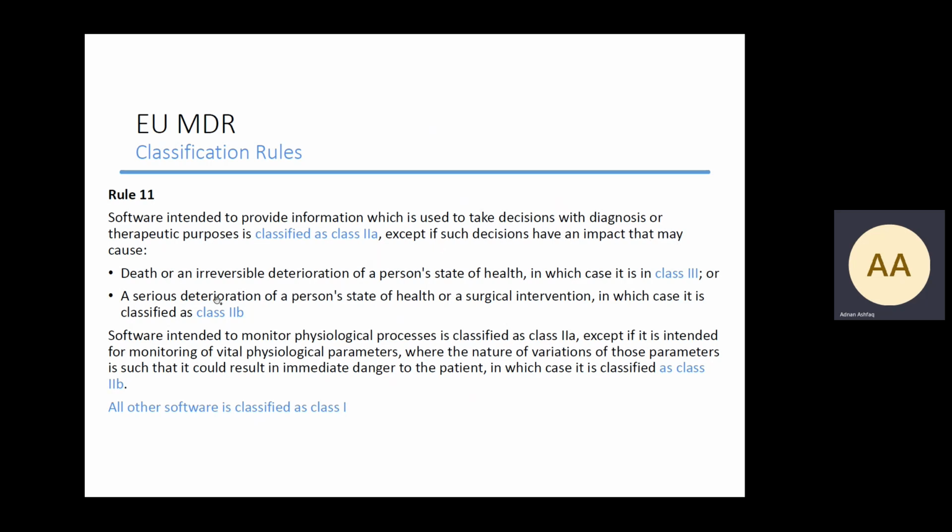such decisions have any impact that then there is death or irreversible deterioration of a person's state of health, which then becomes a class 3.